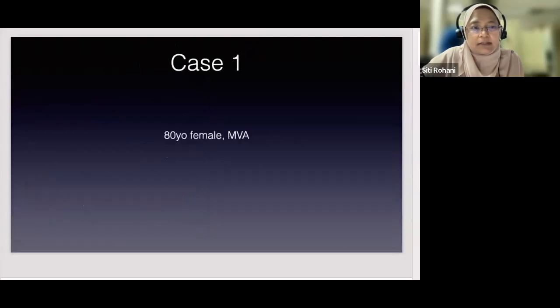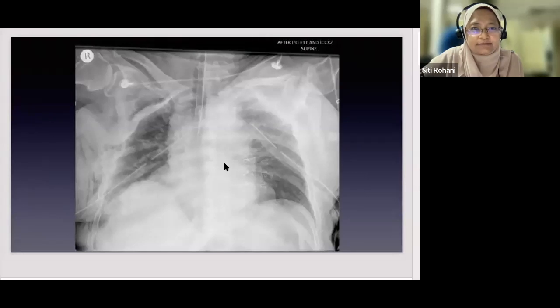Okay, now let's go to case 1. This is an 80-year-old female with MVA. It's very unfortunate.